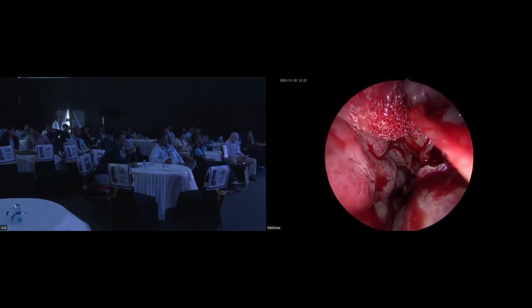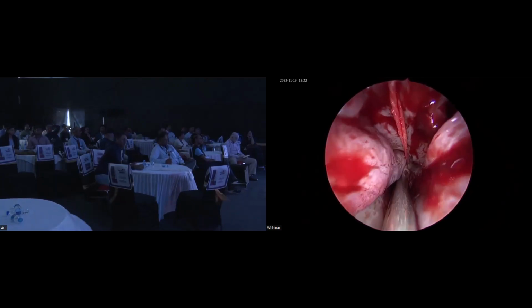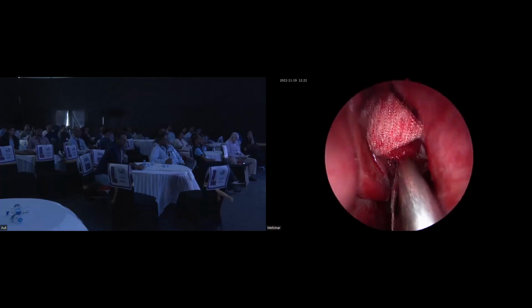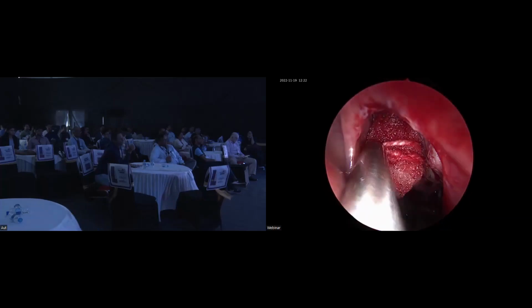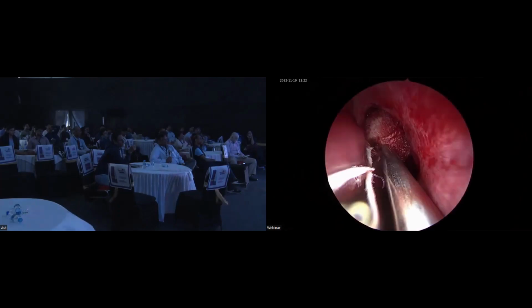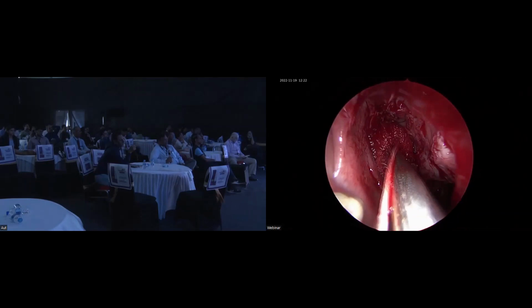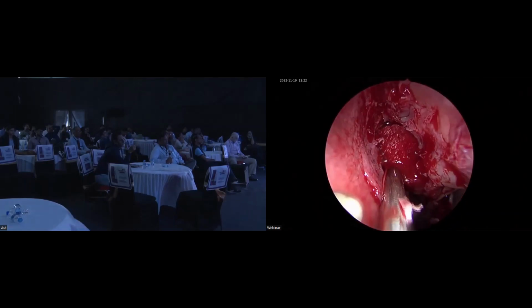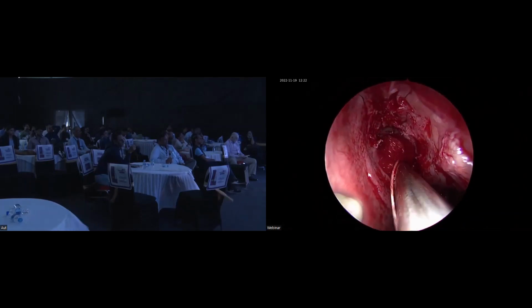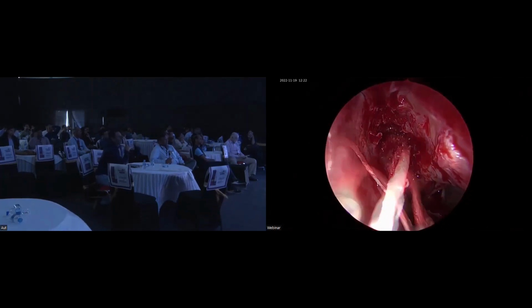Usually the best case to demonstrate the surgery is a case of sinusitis where the landmarks are all preserved. Here, because of the presence of polyposis, which is also quite significantly reduced after the course of steroid, the landmarks are lost. As you saw in the scan also, you were not able to see the bony landmarks. Yes, ma'am. Because almost everything was whited out.